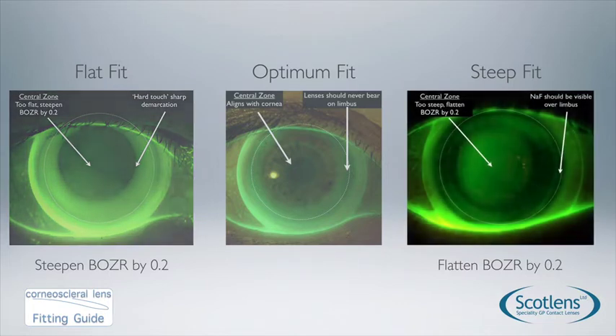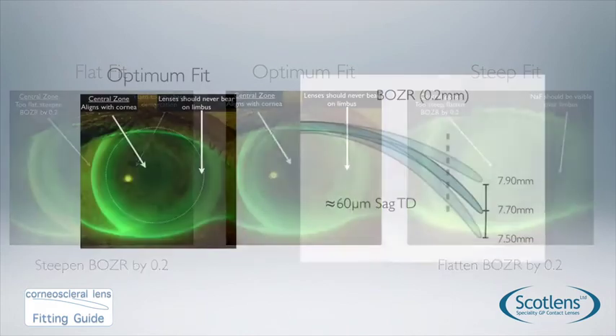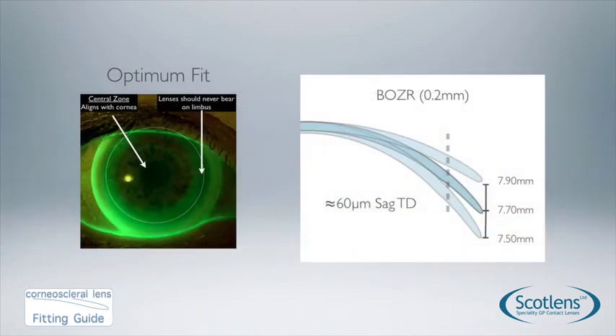If we have a steep fit, you can see there is central pooling. This may provide a little instability after blink and tear debris can get trapped in the visual axis, causing the vision to blur up during wear. If you see a fit like this, flatten the base curve by 0.2mm. Base curve changes need to go in 0.2mm steps — just as with soft lenses we don't work in 0.1mm steps.